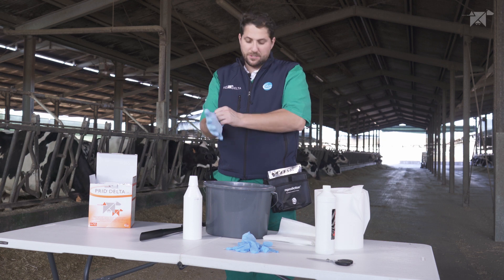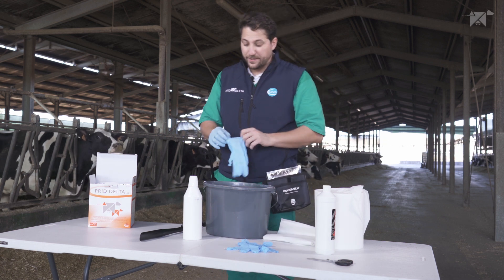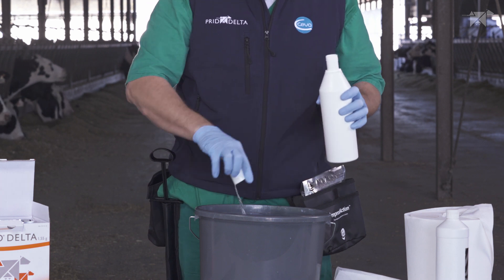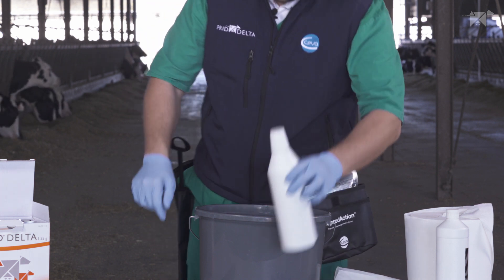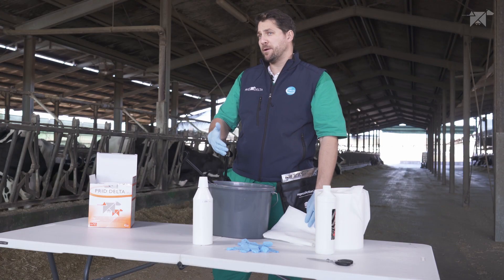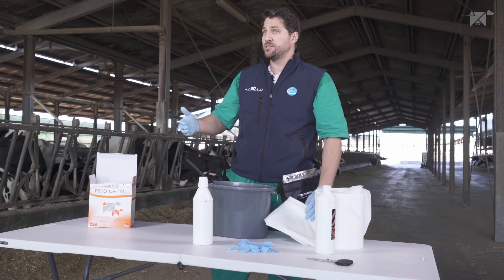By wearing disposable gloves, we're going to start preparing the applicator by introducing the non-irritant disinfectant solution in clean water. We should leave the applicator and disinfect it every time that we apply a new Predelta device in each of our animals.